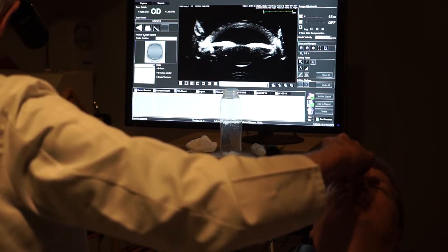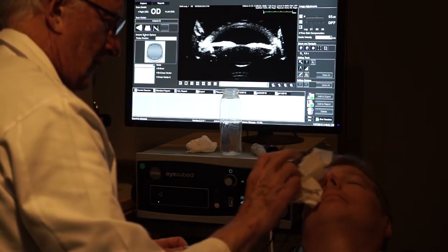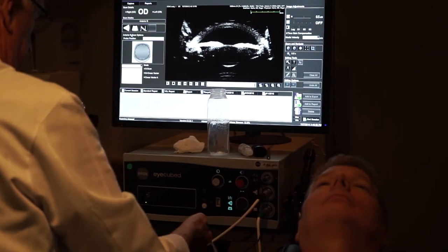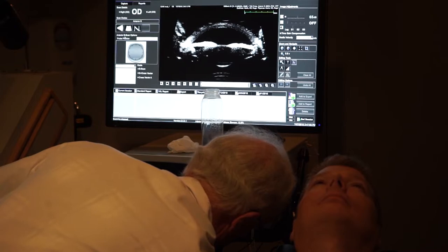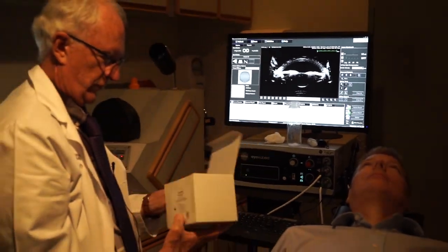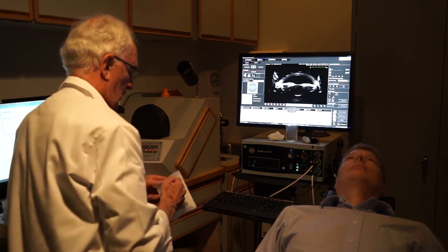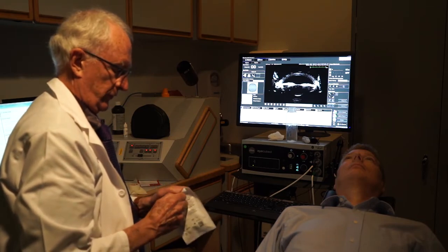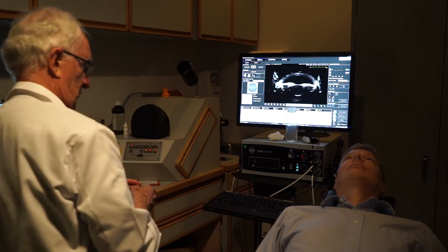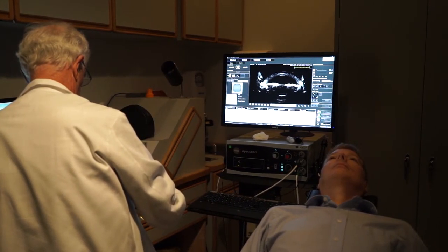You can also use a little bubble cover placed over the tip to do the same sort of thing. These you can buy in different brands; this one is adapted for this machine. The advantage is that you don't have to use the lid holder shell, so for a child or somebody with tight fornices or other issues, I would probably use this over the immersion shell. I don't get quite the same view with it, so I tend to prefer the shell, but it can be very helpful in those cases.